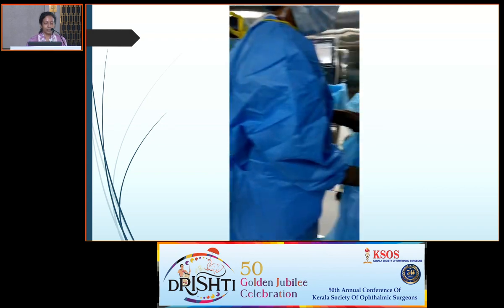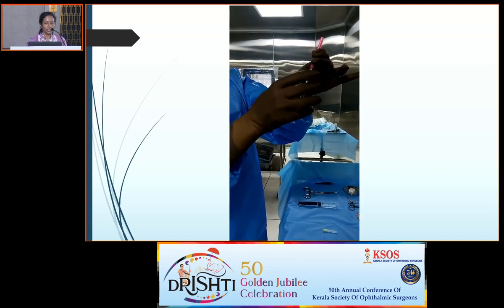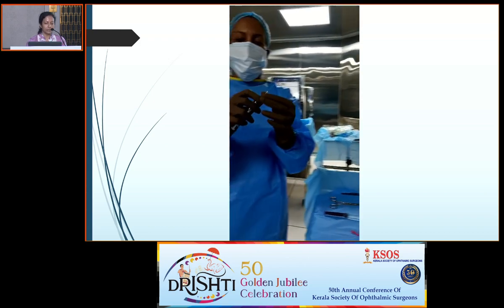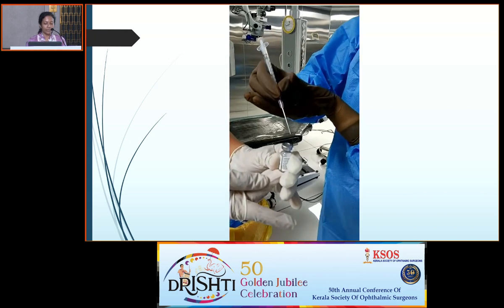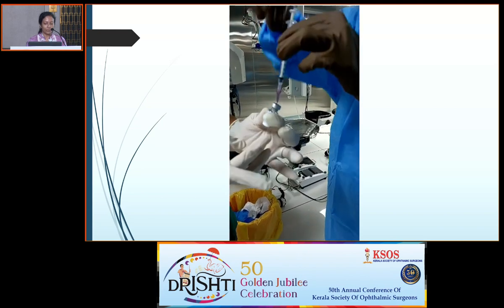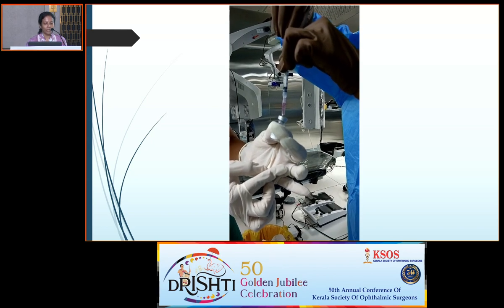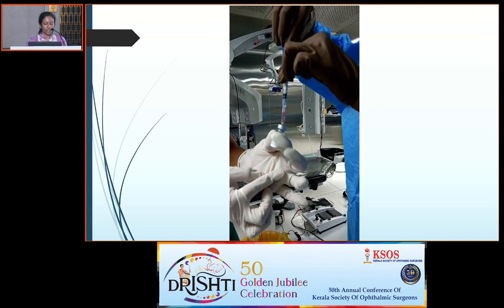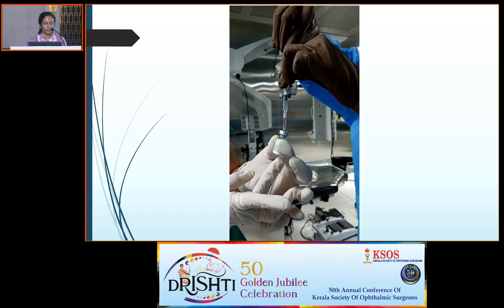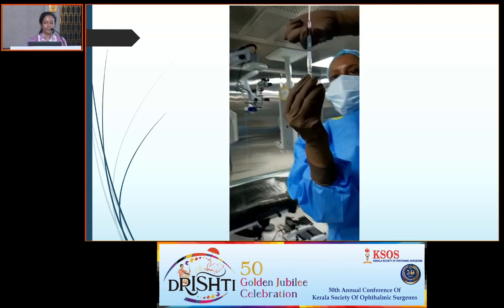Now very carefully, I put on the filter needle. This is a filter needle that is used for withdrawing the injection, and carefully remove the cap so that you don't touch anywhere. The tip of the needle does not touch anywhere. And very, very carefully pierce the center part of the rubber cork and push it down. And as you can see, the sister is slightly tilting the vial so that I can withdraw the injection fully. So I have withdrawn the injection now, and after I withdraw it, I catch hold of the filter needle and pull it out and make it upside down.